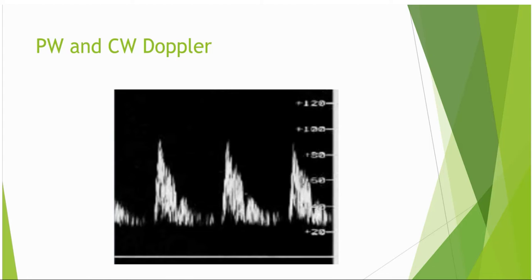Wall filter settings are good at also removing unwanted content from the spectral trace, but it does so in a very different manner to reject. This setting removes all signals from the trace at low Doppler shifts or velocities. This is good to remove structures such as vessel walls or heart chambers that will generate very strong signals but move at low velocity compared to blood flow. Therefore, reject works to remove weak signals regardless of velocity. Wall filter will remove low velocity signals regardless of strength.